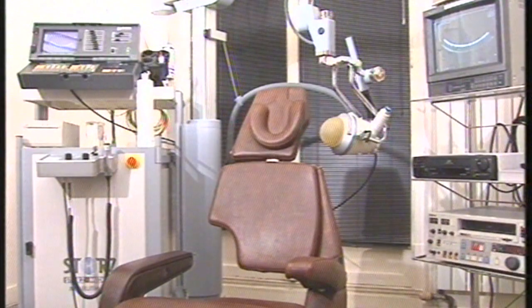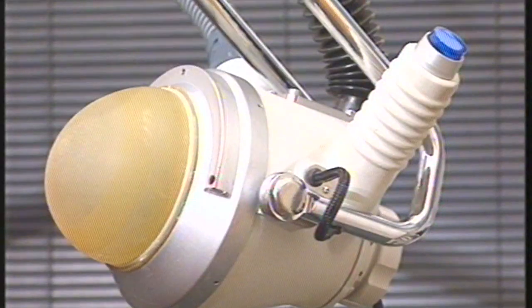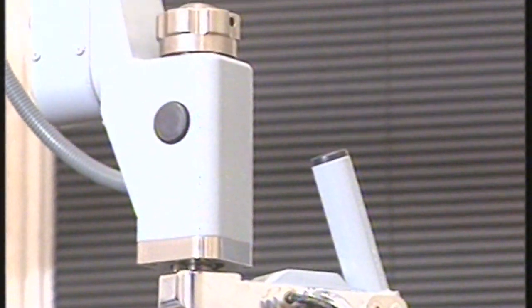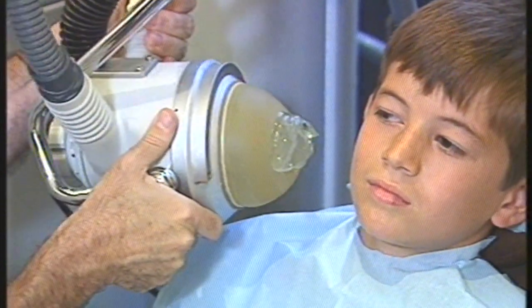We presently use a new electrohydraulic shockwave lithotripter specially developed and adapted to salivary lithiasis. The fragmentation tube is fixed on an articulated arm and has an extremely narrow focus of 2.4 per 25 millimeters. An inflatable balloon allows us to adjust the depth of tissue penetration.